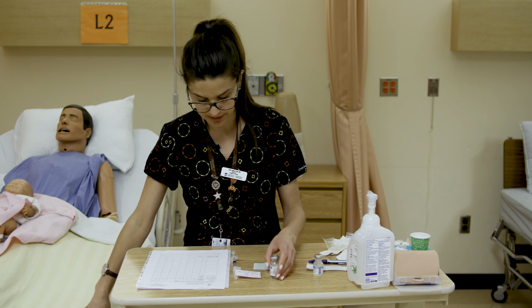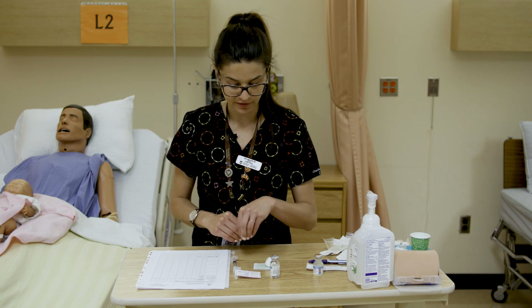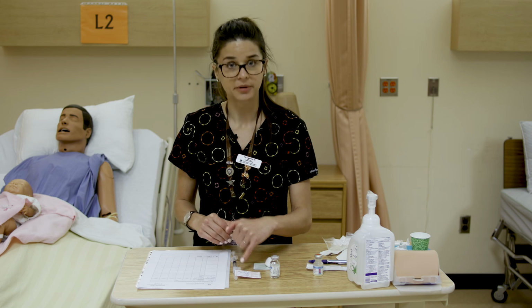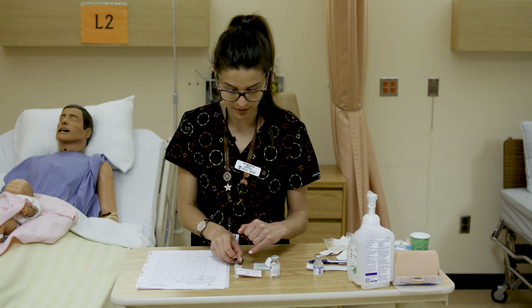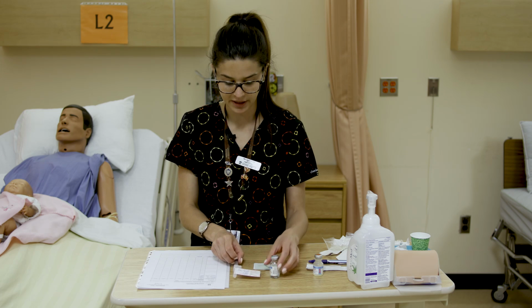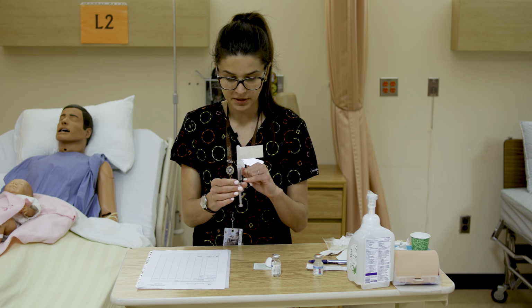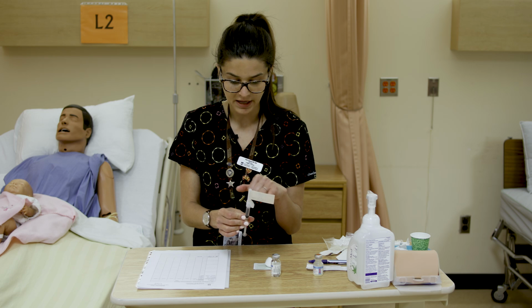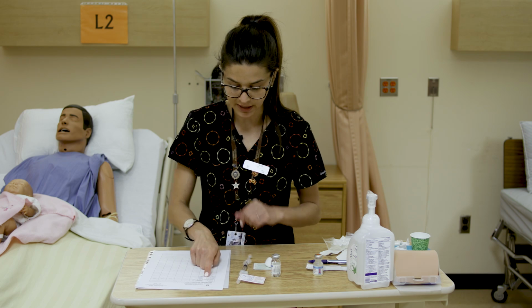So we could recheck this and review that we put in the 3.5 mLs of sterile water to get a 250 milligram per ml concentration. So we've confirmed our dose. The volume is 2 mLs per that calculation and recipe. So we want to make sure we have 2 mLs, because 2 mLs is going to equal our 500 milligram dose if it's 250 milligrams per ml, and the route is IM.